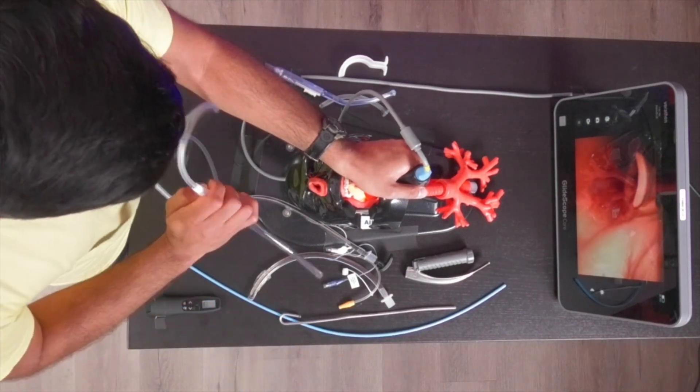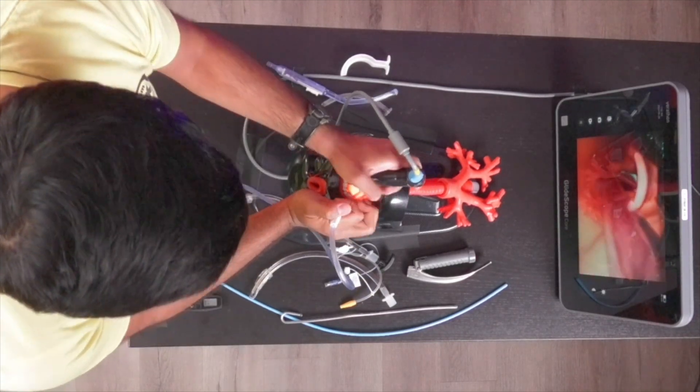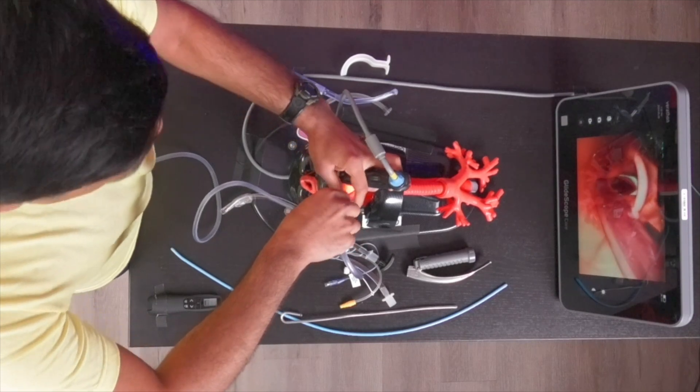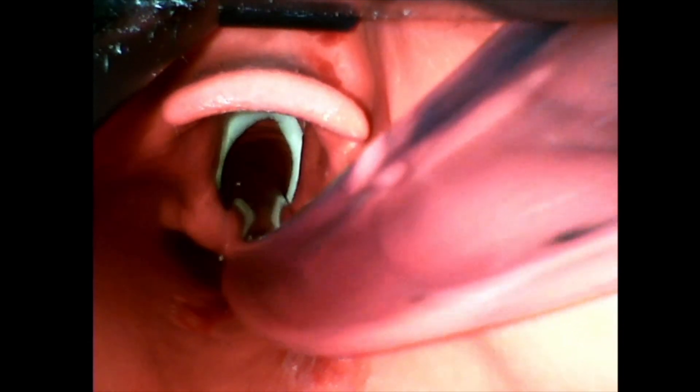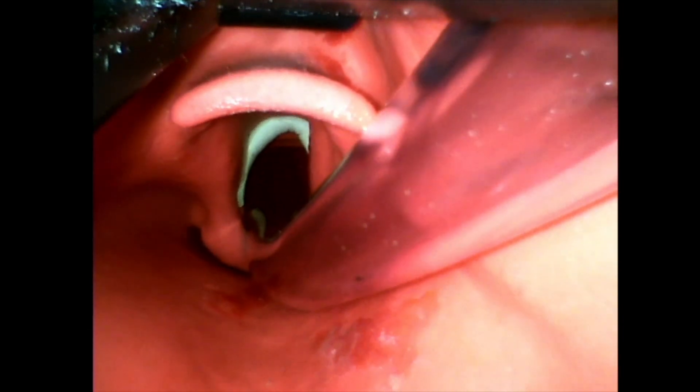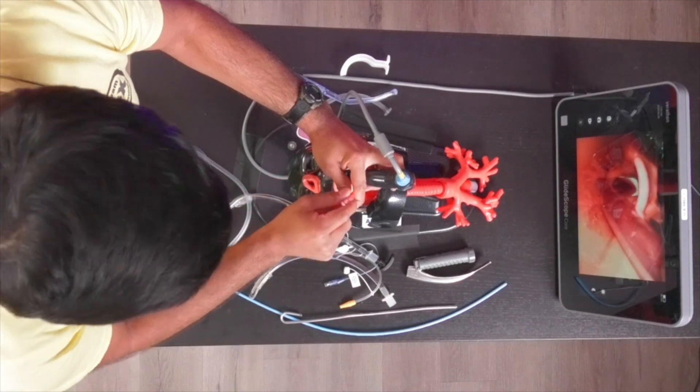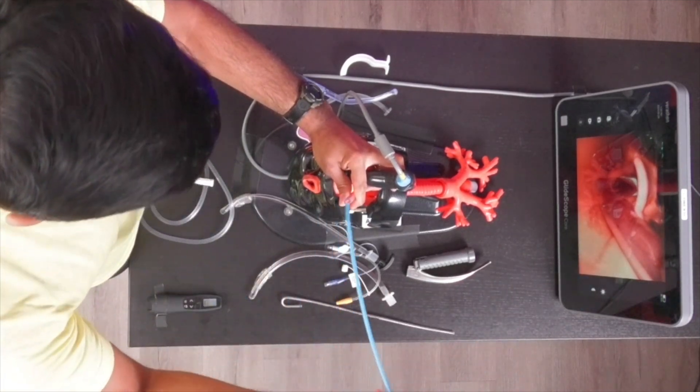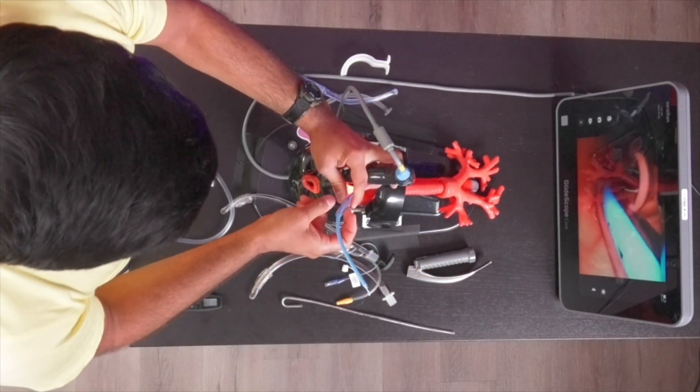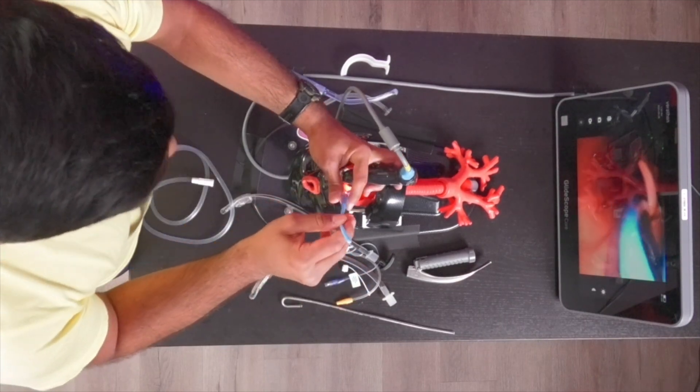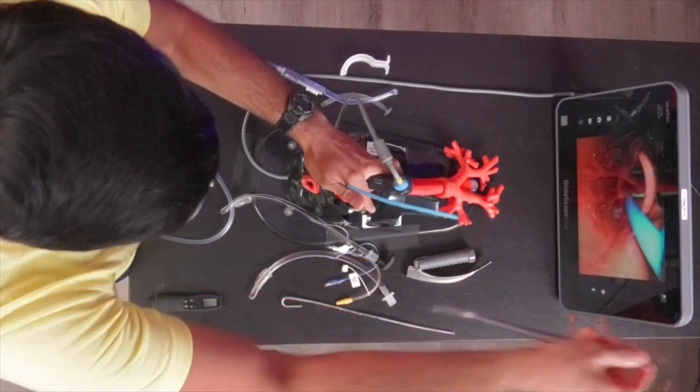The other option is to actually use your DuCanto catheter to place it into the airway. Ian, can we get the glidescope view real quick? What you'll see is I've placed the tip of my DuCanto catheter into the airway. Let's get the overheads now. I'm disconnecting the DuCanto suction catheter from the suction tubing, and I can pass a bougie through this. The diameter is such that a standard bougie will fit through here. Now, using this rigid catheter, you've intubated the airway and passed a bougie through.